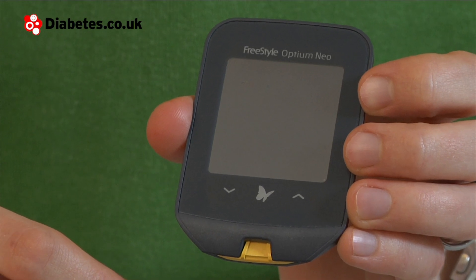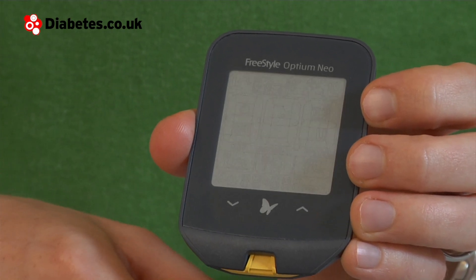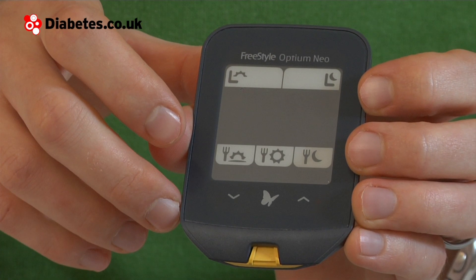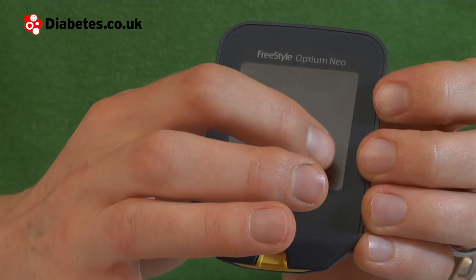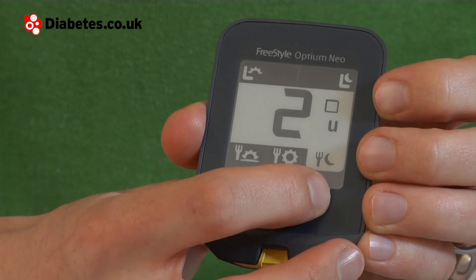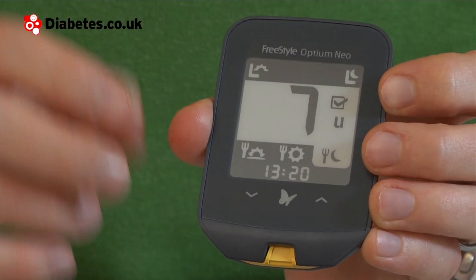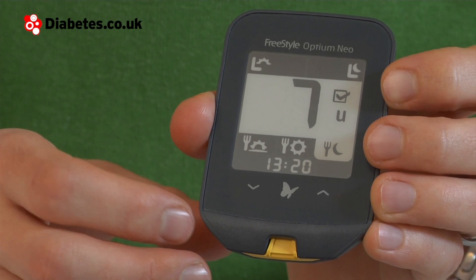You can also log your insulin doses. If you turn the meter on and press the butterfly, which is the on and off button, look for the syringe icon and press that on the screen. Say I want to log a before meal — I press the before meal icon and get a chance to choose my dose. I'm going to choose seven units of quick acting insulin and log the dose by checking the box. So that's now my dose logged.